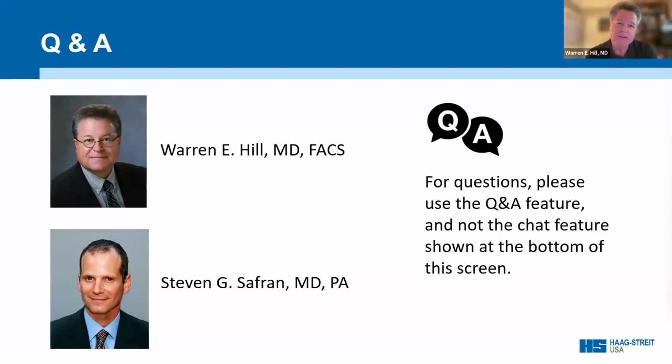But as Steve mentioned, we've looked at entering the posterior cornea compared to using the algorithms. And with current technology, and again, that may change with some of the new OCT devices, the algorithms are as good as direct measurements of the posterior cornea for normal eyes. That's the thing to remember for normal eyes. And I think you can be very confident in using the Barrett algorithm or Abulafia-Koch. Both of them are really quite excellent.